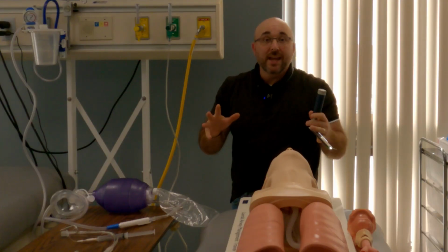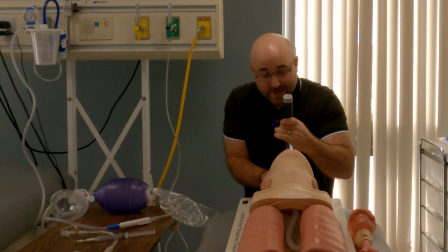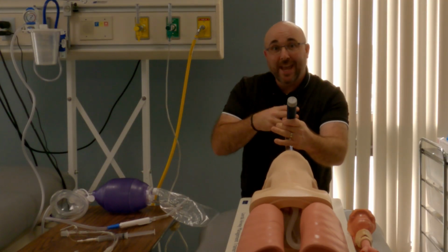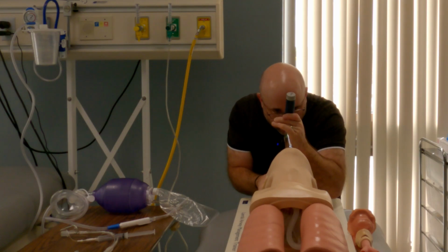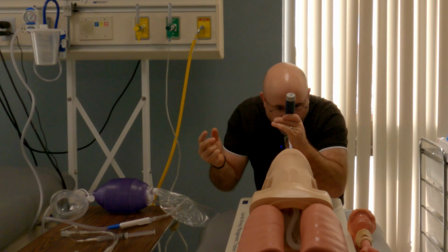When intubating and when you visualize the vocal cords, you're going to want to keep your eyes on the vocal cords. But the assistant on the side is there to hand you things as you need them. So I'm going to go in and find the vocal cords. I see the vocal cords. There's the glottis, the opening. I'm going to say, can you hand me the endotracheal tube?